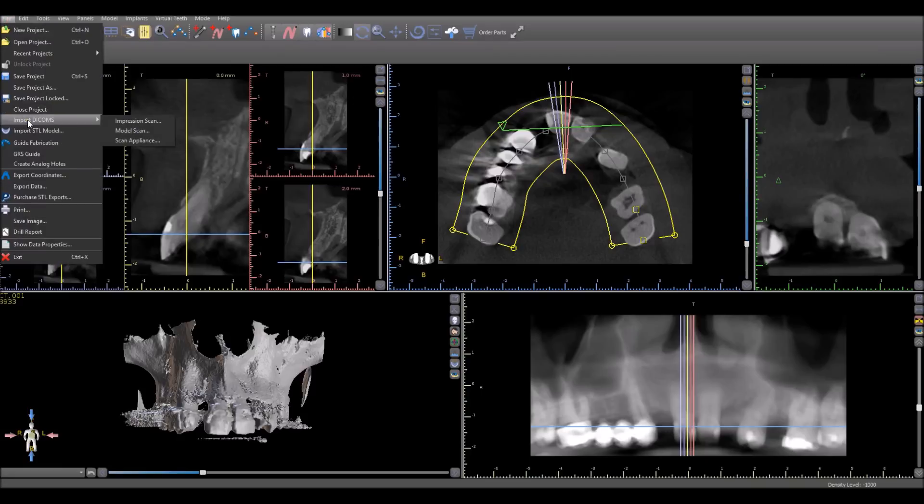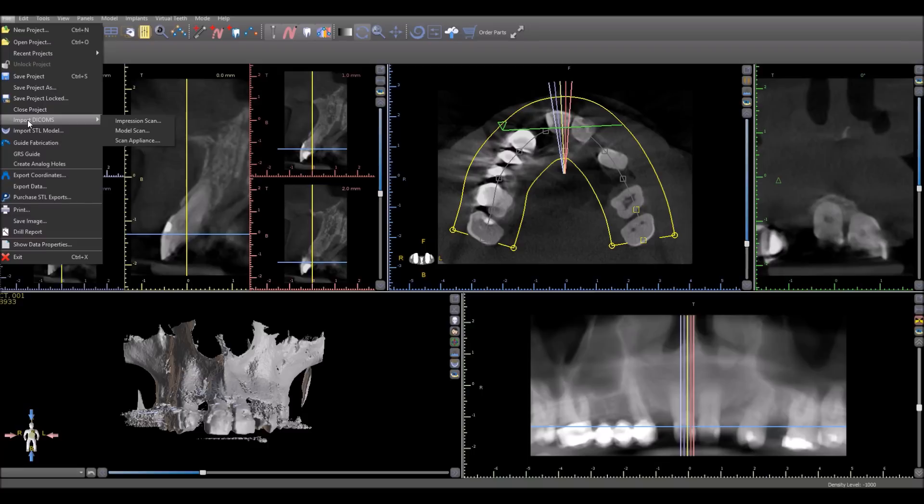The software opens a flyout menu that allows us to choose between importing an impression scan, a model scan, or a scan appliance. Depending on what is selected, the software will take us through a short process flow to import the relevant item.